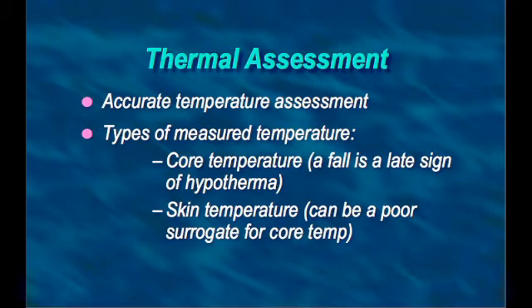And then there's skin temperature, which is a probe on the skin. So some may use an axillary temperature and a skin temperature. It's important that they're not measuring the same thing. The skin is measuring the temperature on the skin, and you're trying to assess the core. So as the skin temperature drops, the core may be maintained, and the difference is an important number so that you can sort of estimate how much the baby's trying to do to maintain the temperature.